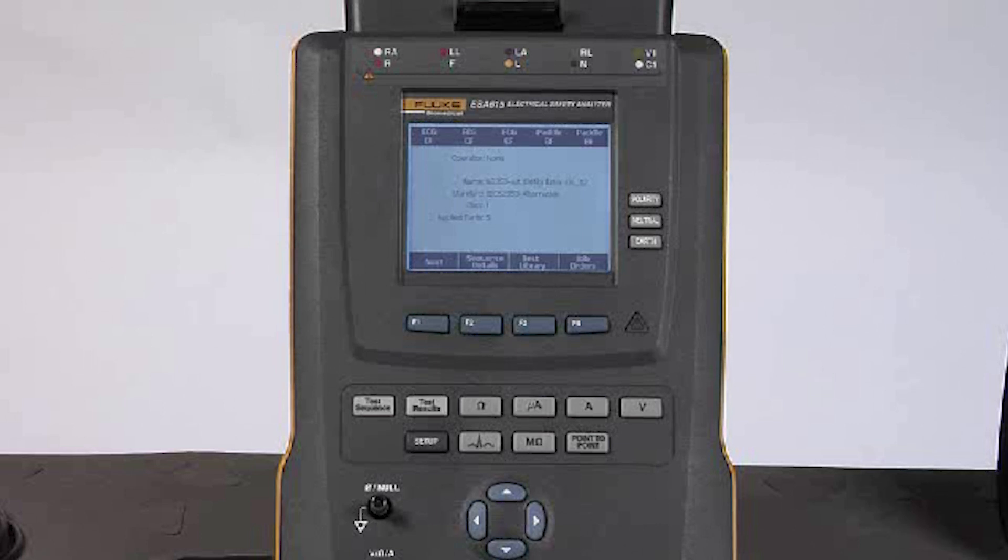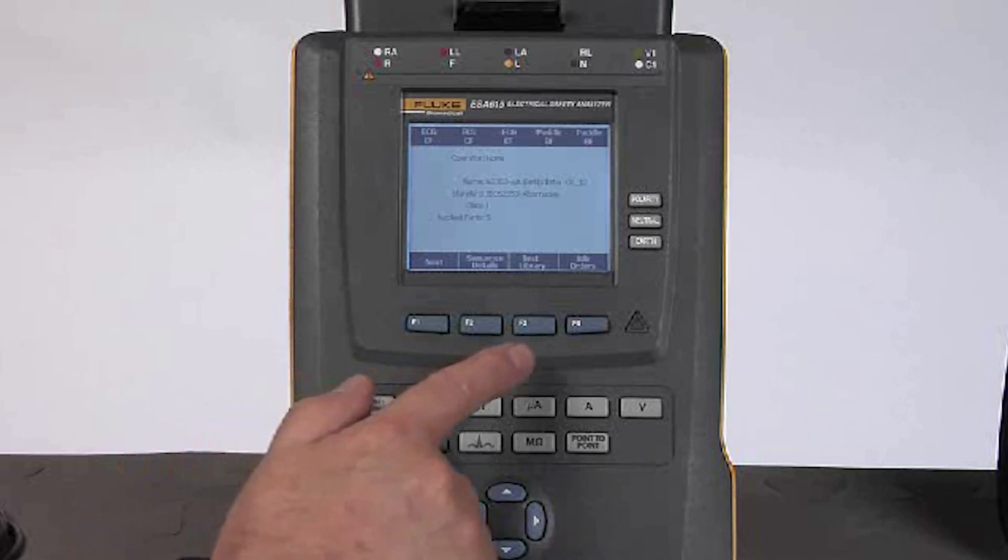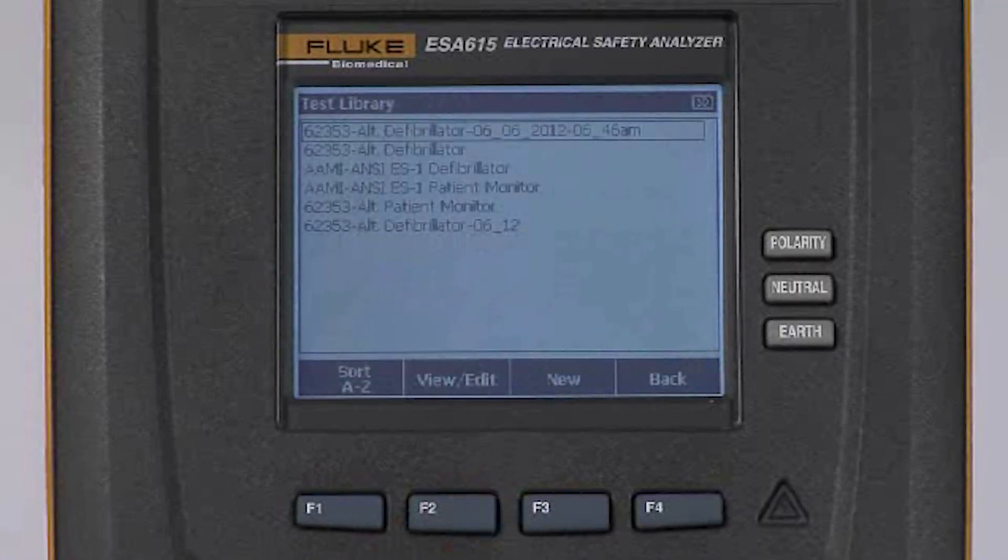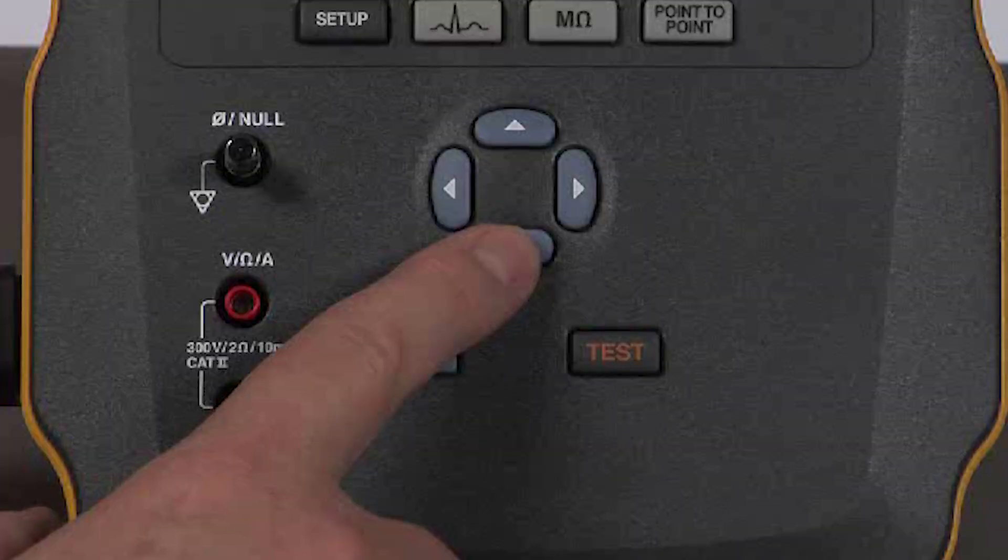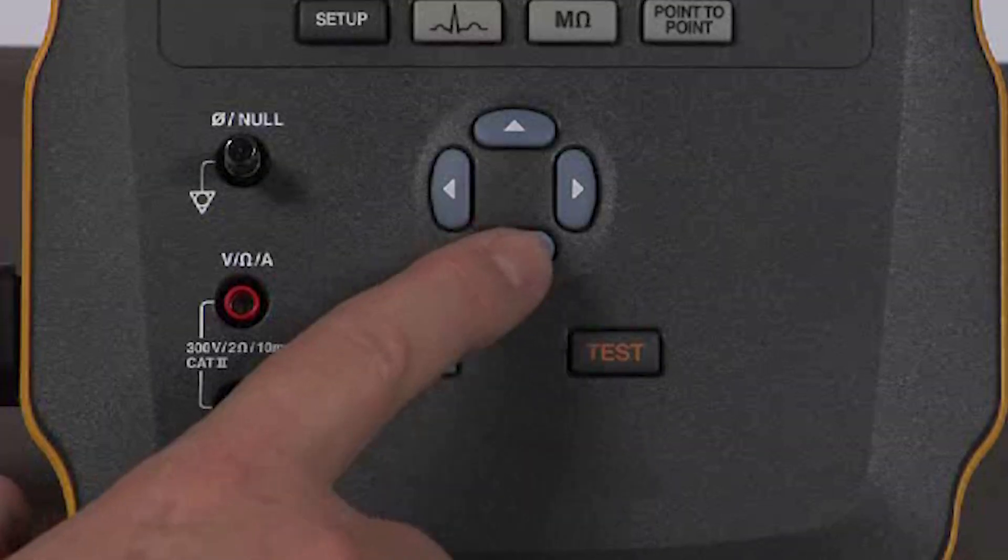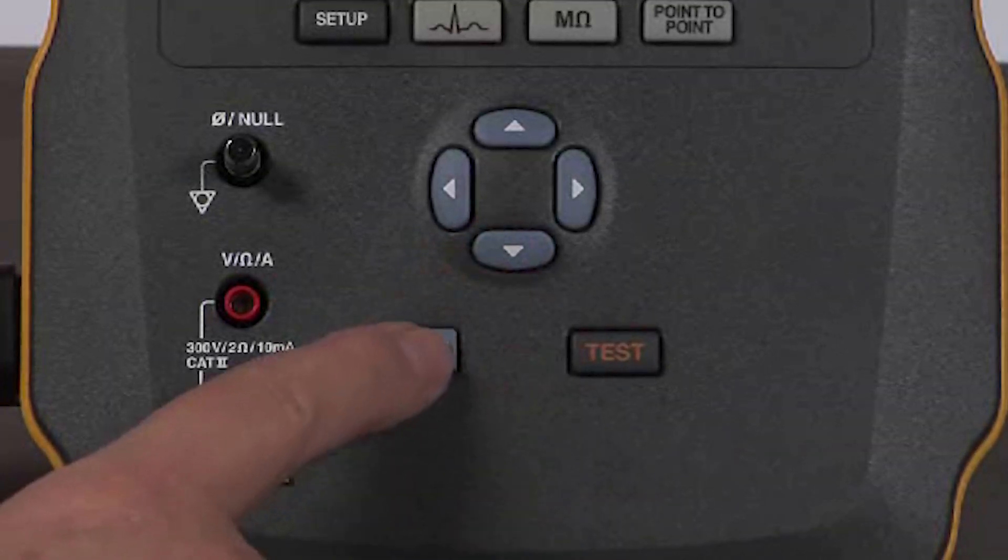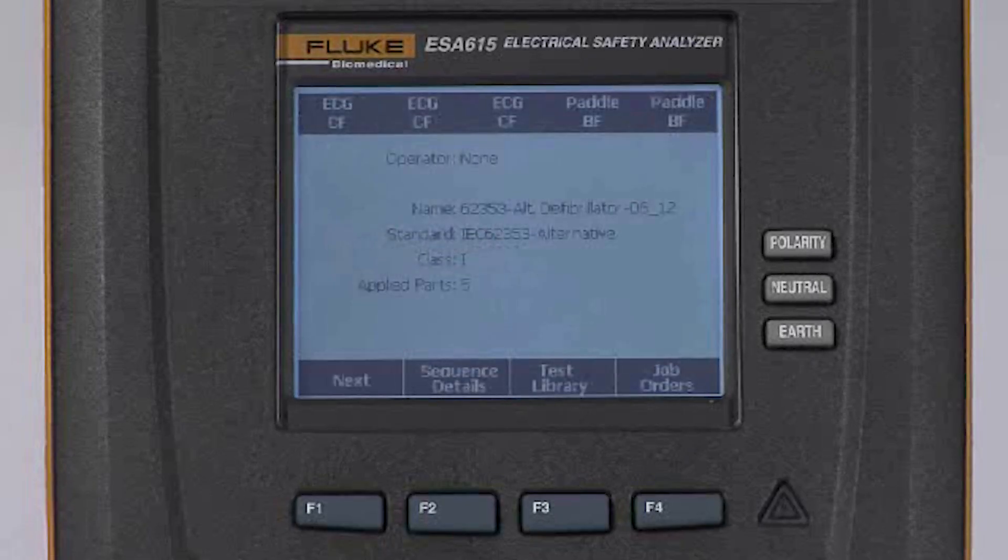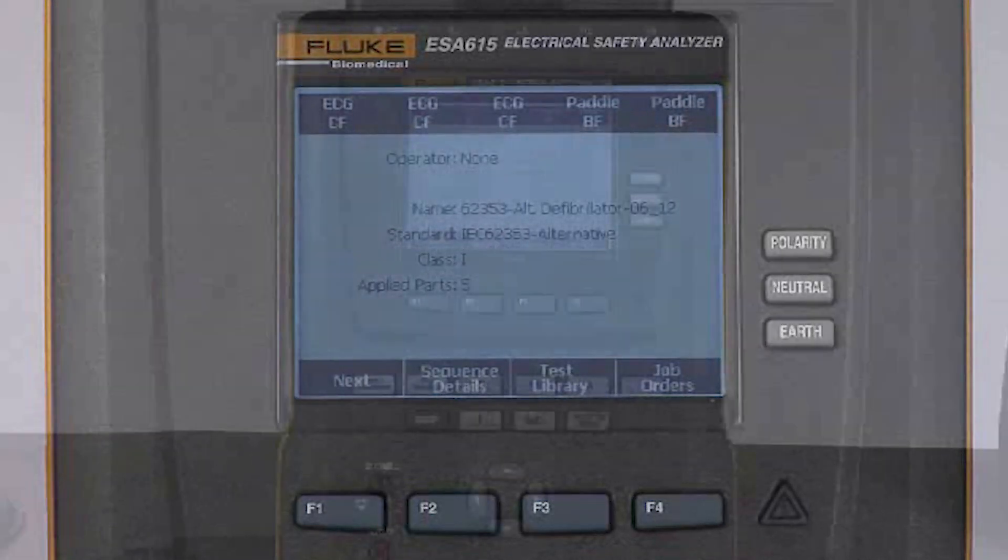I would select F3 and then I can use the navigation arrows and the enter button to select the test sequence that I wish to run.